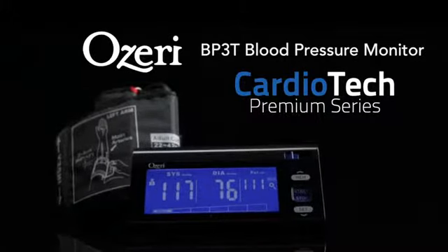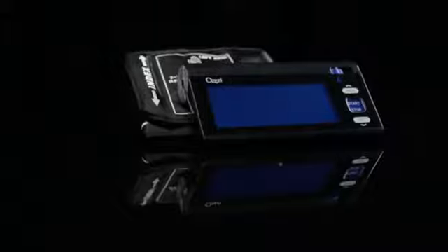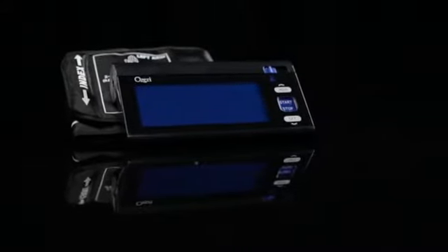Portable, accurate, and clinically proven, this is the Ozeri BP3T Upper Arm Blood Pressure Monitor.